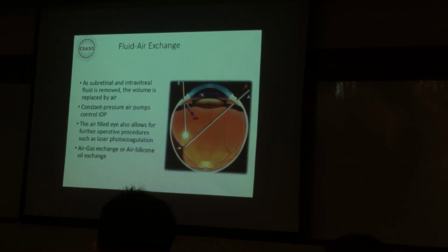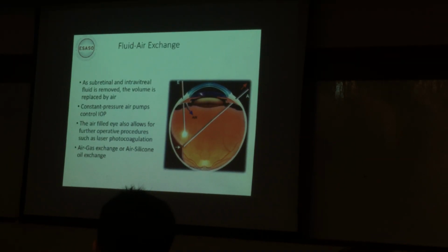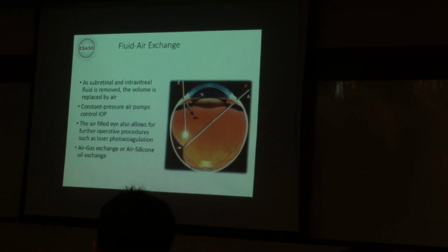Obviously fluid air exchange is done intraoperatively during the vitrectomy procedure, and you can either do air gas exchange, or some people do air silicone oil exchange.